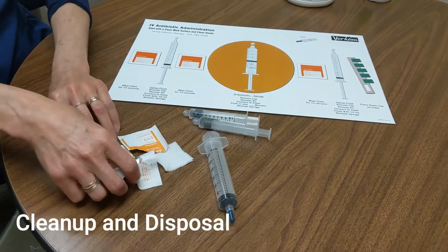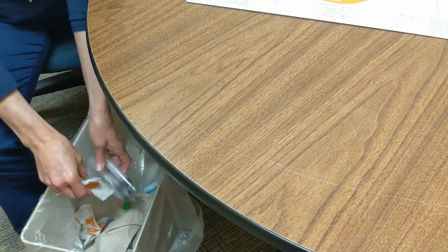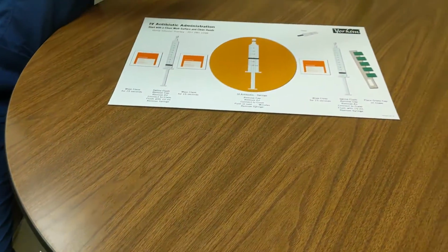Go ahead and throw the used alcohol swabs, caps, and syringes in the regular trash. Clean your teaching mat and put it away for next time.